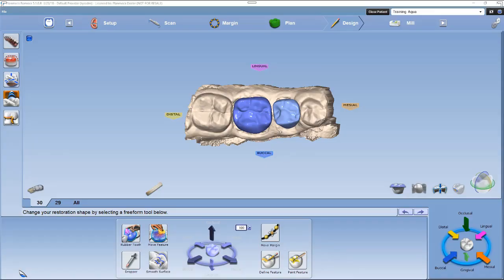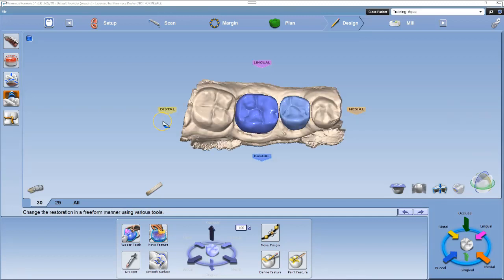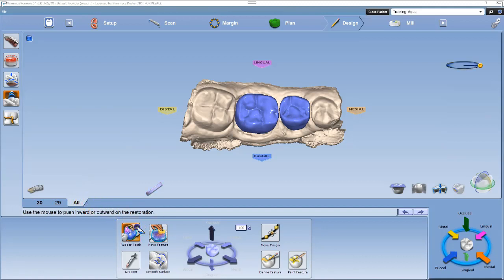In this case we have numbers 29 and 30 to design. Before we get started, let's select the tools that we will need. Left-click the All tab to make both teeth active to adjust, then select Rubber Tooth to make the adjustments as needed.